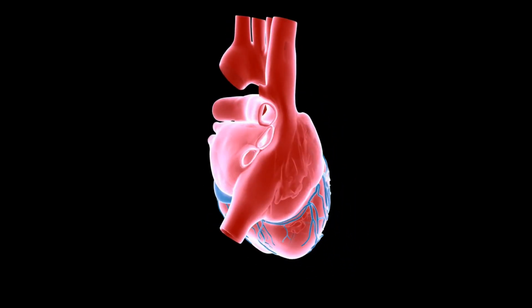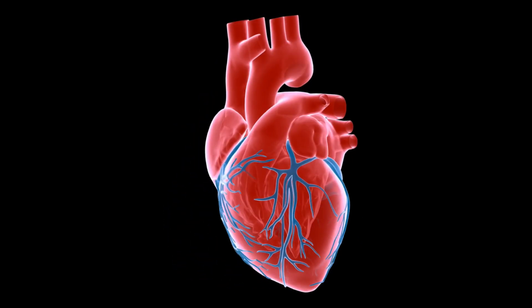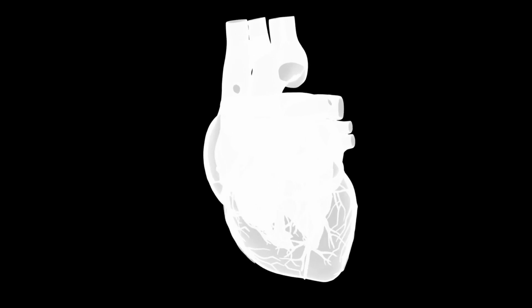Hypercalcemia and hypocalcemia are two conditions that affect the levels of calcium in the blood. They can have significant effects on cardiac electrical activity, which can be observed through electrocardiogram changes. Let's explore the ECG changes associated with each condition.